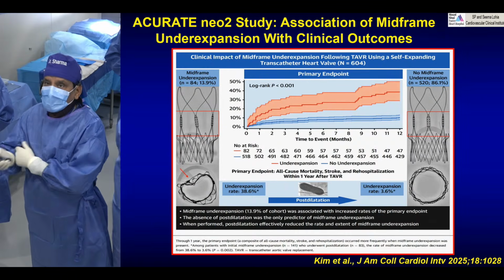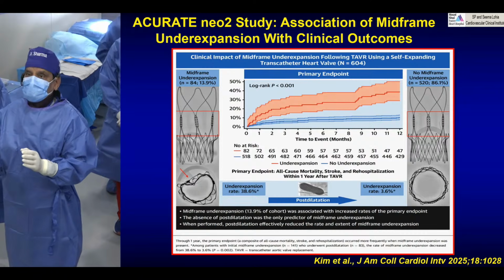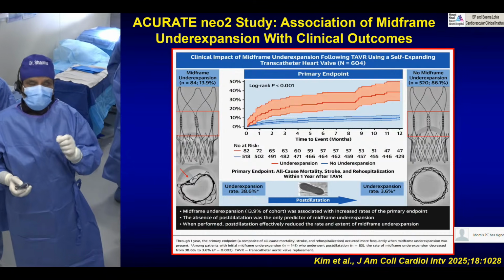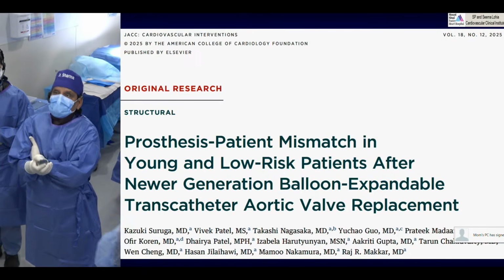The key is, when you're doing a self-expanding valve, make sure it is fully expanded, and we did in this case as much as possible, but it still remained mild. So with self-expanding valves, full valve expansion is very important.